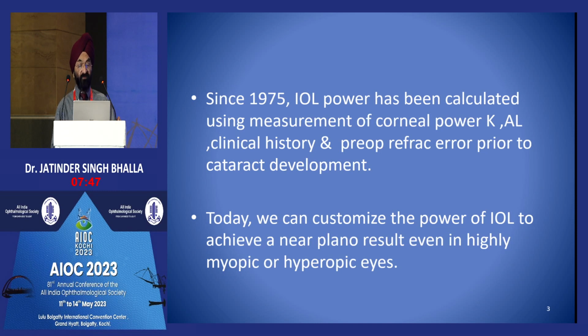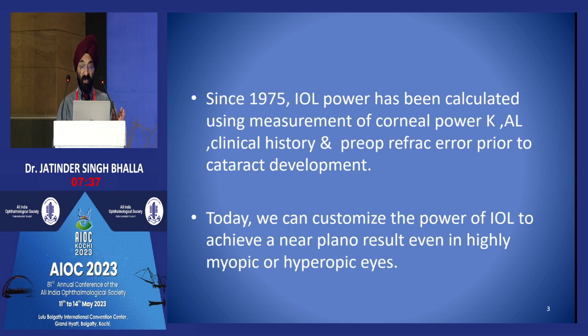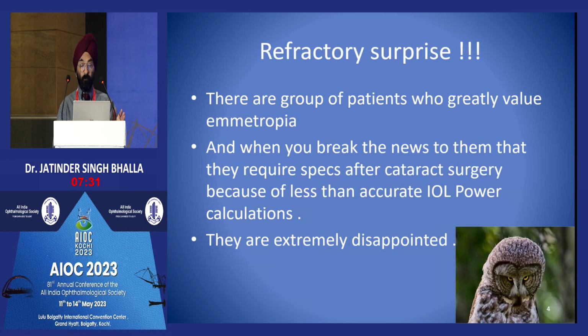So since 1975, IOL power has been calculated using basically two parameters, that is keratometry and axial length. But now today we can customize the power of IOL to achieve near plano results even in highly myopic or hyperopic eyes. And there are a group of patients who greatly value their emmetropia. And when you break news to them that they require spectacles after the cataract surgery, they are extremely disappointed.